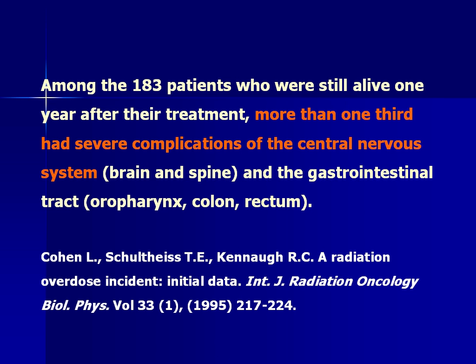Yes, right. And this is where the Scottish government investigated the incident. It was a series of QA problems, including mistakes that were not caught at chart check time, which should have been. The patient received 19 of their 20 treatments before the problem was found. So she was severely overdosed, and then the Scottish government investigated the incident, and here's the 100-page report. It's very clear, and it can certainly be found on the web, but this was a clear failure of QA practices and redundant checks.